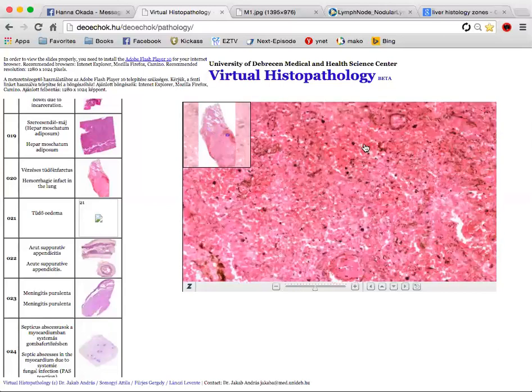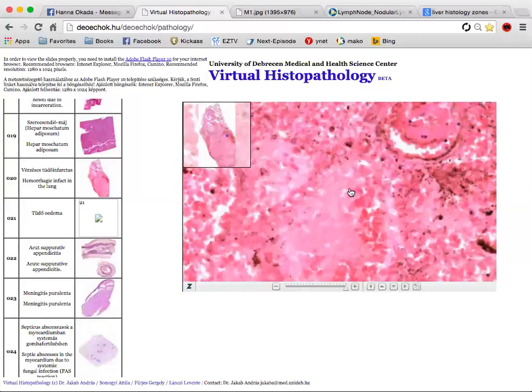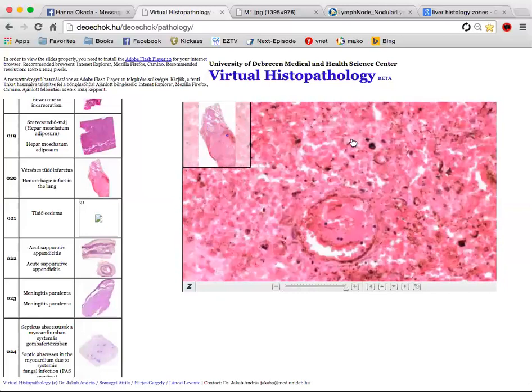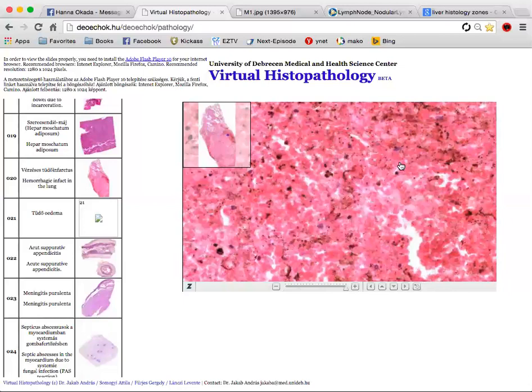Here you can see that you can't even see the normal lung architecture. So this is all just one big mass, and what you can see here is the dead tissue, the necrotic tissue, and red blood cells, because this is a hemorrhagic necrosis. So red blood cells infiltrate the parenchyma of the lung also, because there's one circulation that's blocked off, and then you have one that's still working, and the blood just spills. It's not infiltrating, it spills into the tissue.